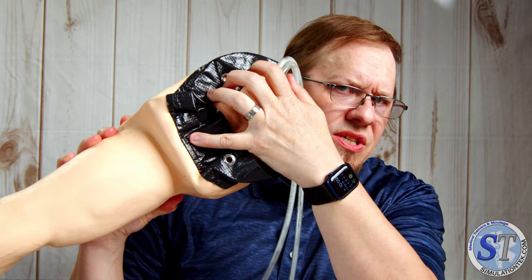A lot of times doing an IV arm, I recommend having two people, but sometimes in these lone shops, we just have us. I've done it by myself, though not on this model in a long time. I've done a lot of Laerdal IV arms for 3Gs, old SimMan Classics, things like that, but I haven't done one on this one in a long time. Usually there's a shoelace kind of tie-up that bunches this up. I took that off at the shop months ago, and it's back at the shop. So this is in my shop, so we can see how this is going.